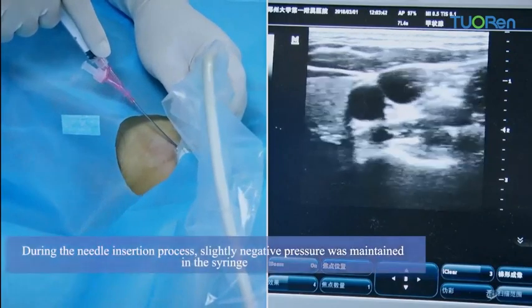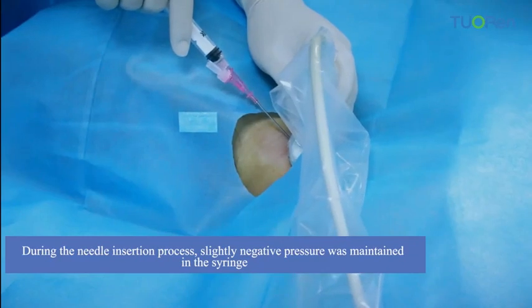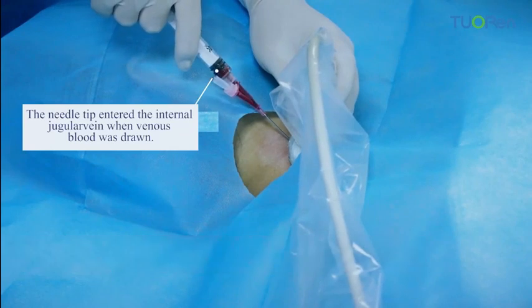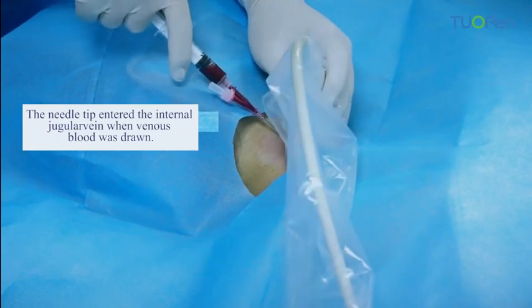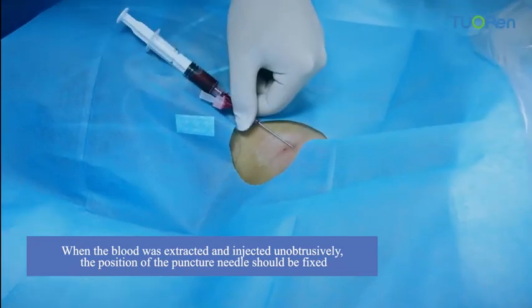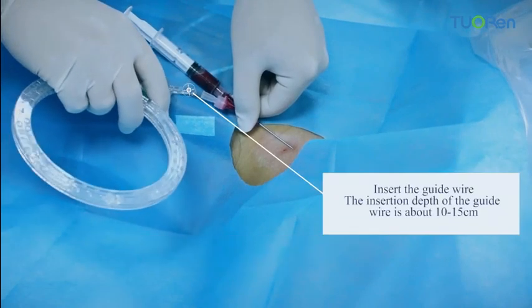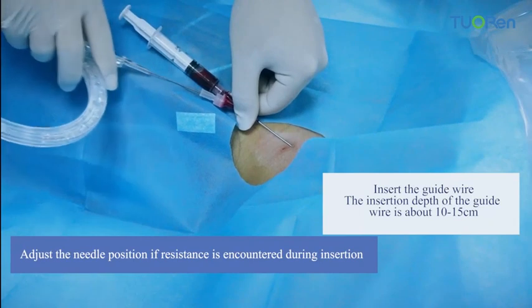During the needle insertion process, slight negative pressure is maintained in the syringe, and the needle tip has entered the internal jugular vein when venous blood is drawn. When the blood is extracted and injected unobstructed, the position of the puncture needle should be fixed, and adjust the needle position if resistance is encountered during insertion.